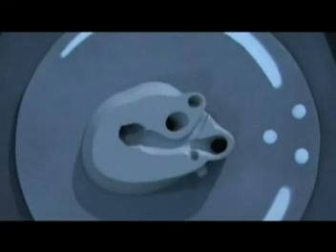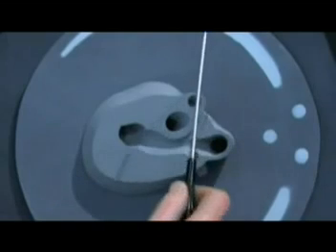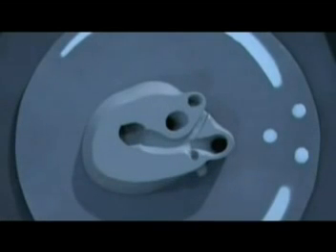Coming down the pulmonary outflow, when it's more or less alongside the ascending aorta, the right branch comes off, but in this view it'll be heading up towards us and won't be well shown. The left branch tends to disappear down into the lung and heads slightly more inferiorly, and so it's slightly more difficult to see. As soon as the branches come off, this is the ductus arteriosus heading down towards the descending aorta.